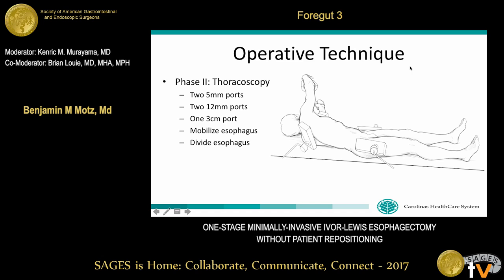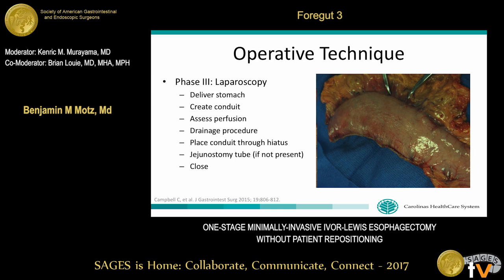At this point, we rotate the patient towards the right, putting the chest into a semi-left lateral decubitus position. Two five-millimeter ports are placed — one at the inferior angle of the scapula and one inferiorly at the posterior axillary line. Two 12-millimeter ports are placed at the anterior axillary line, and we make a three-centimeter incision to accommodate the post of an endoscopic circular stapler. We mobilize the esophagus further into the mediastinum ensuring adequate margins, assessed using EGD and preoperative imaging, then divide the esophagus with a linear stapler. We then deliver the stomach and distal esophagus through the hand port for extracorporeal conduit construction.